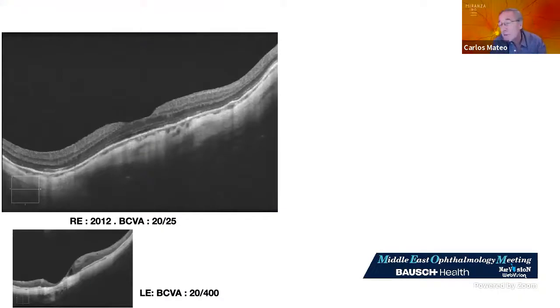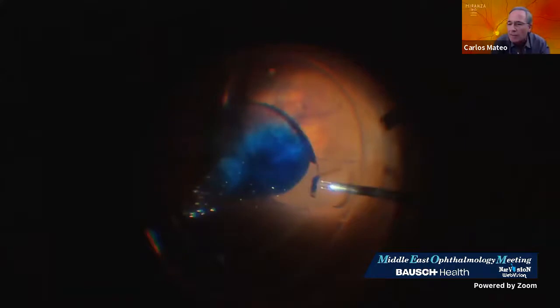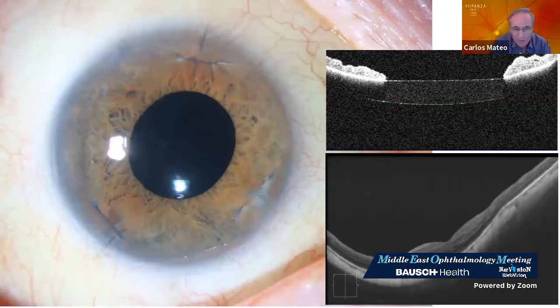But as a vitreoretinal surgeon, you have to be aware of this because imagine this patient has a high myopia, and suddenly she developed a macular hole with decreased vision in her only eye. And then I started my vitrectomy, as you can see here, only peripheral vitrectomy, and then I went down, and knock, knock, the lens fell down. Then you have to be used to manage this. And this is the aspect of the patient after doing this.